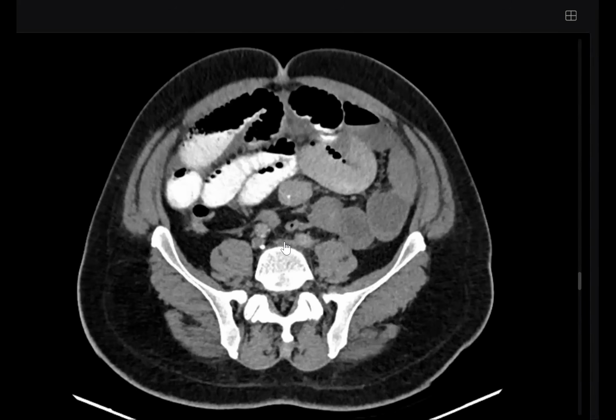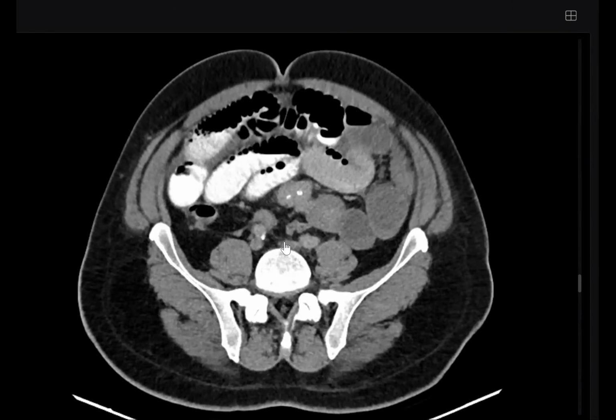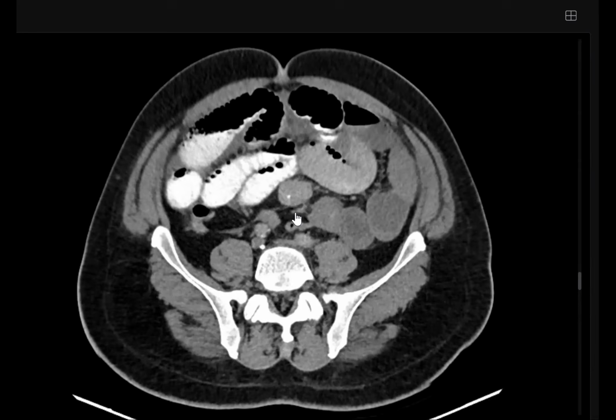Excellent. What type of nuclear study can be suggested? So that would be 111 indium octreotide or DOTA-TATE PET CT. Excellent. Octreotide scan or DOTA-TATE PET CT, not FDG. Very good, my friend. Very good.